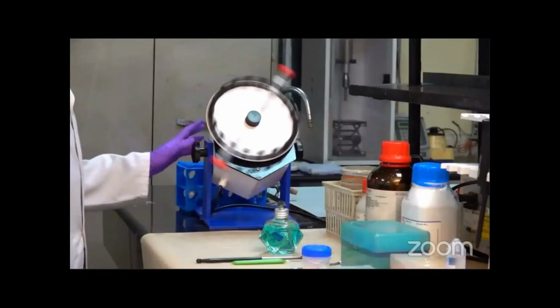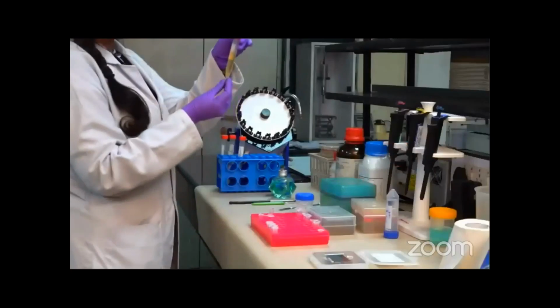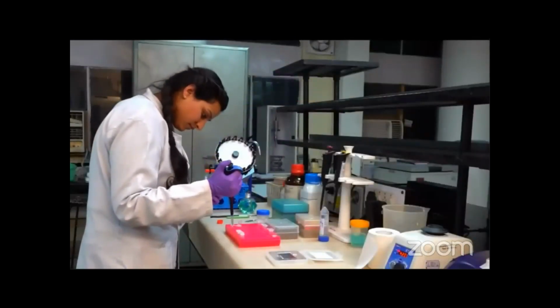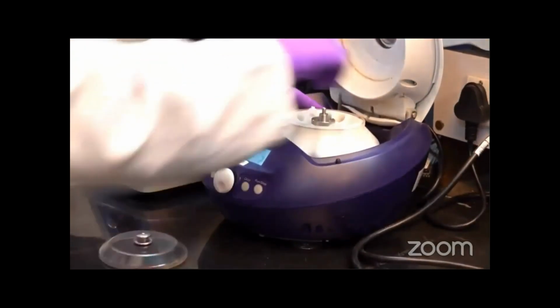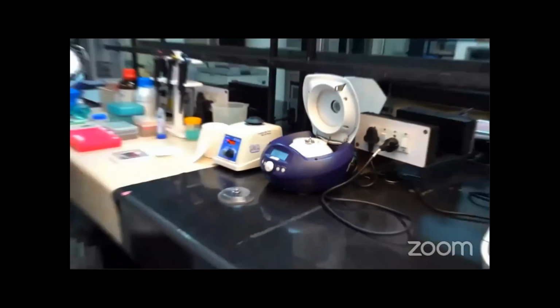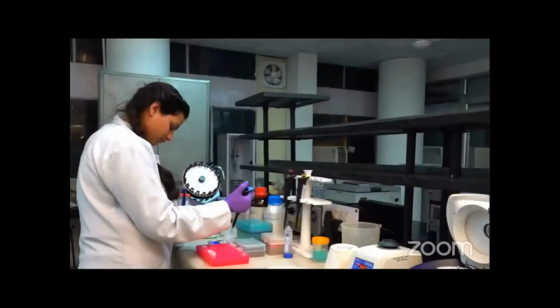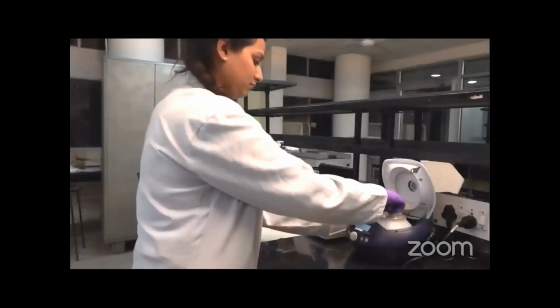For growth in liquid media, we can use a rotospin as shown here. This is a picture of growth in liquid media grown on rotospin. We take the growth from the liquid media with the help of a pipette and place it inside a centrifuge tube. This must also be washed just like the solid media growth. After washing with double distilled water, the final wash must be made with ethanol. After the ethanol wash, this centrifuge tube is centrifuged to form a pellet.